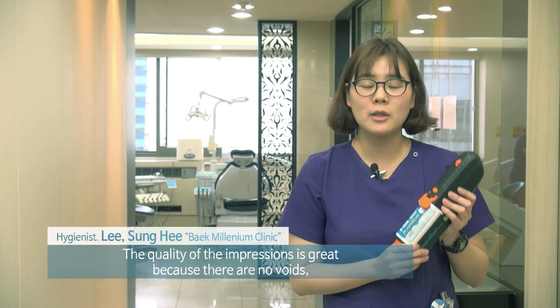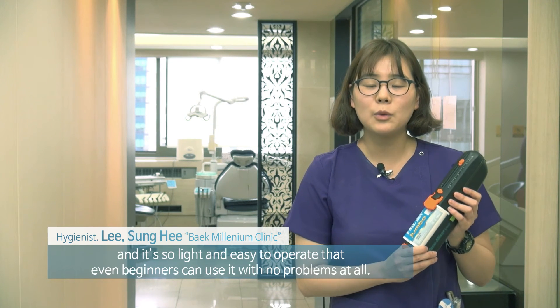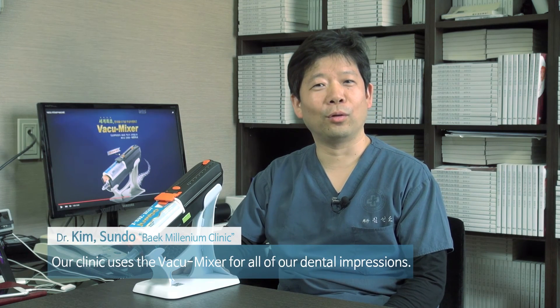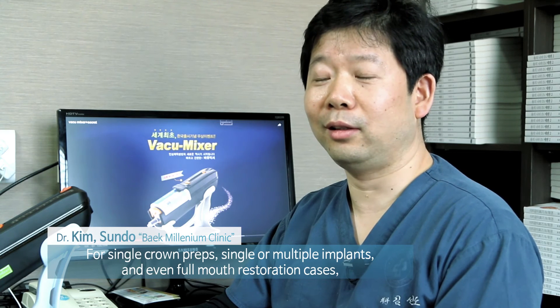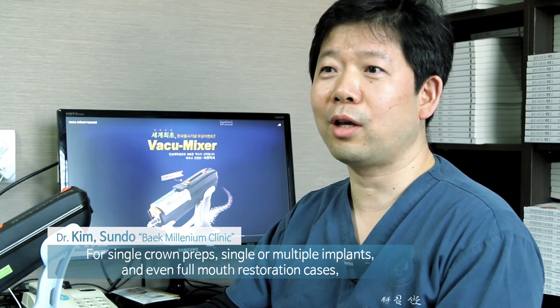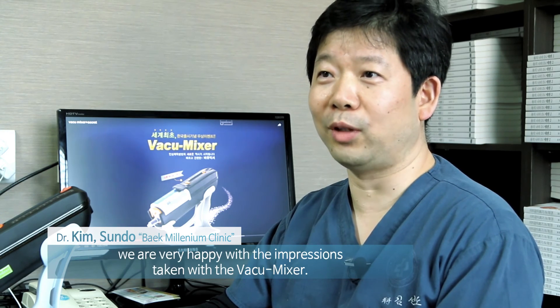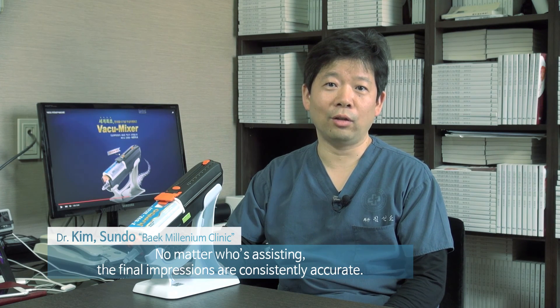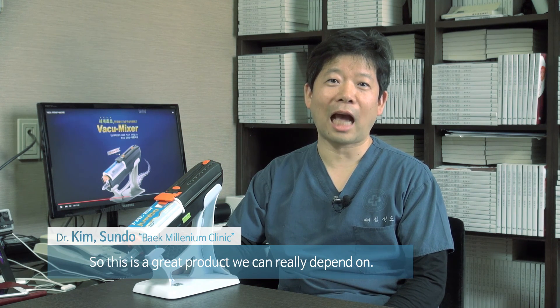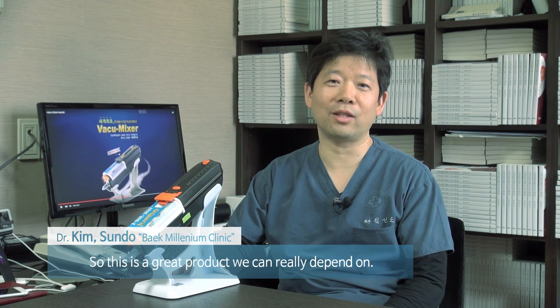The Vacuum Mixer produces void-free impressions of high quality, is lightweight and easy to carry, and can be used easily even by unskilled operators. Our clinic uses the Vacuum Mixer for all impressions — single crowns, implant singles and multiples, and even full-mouth cases without difficulty. Regardless of which assistant performs the impression, the quality comes out consistently, making it a reliable mixer we can use with confidence.